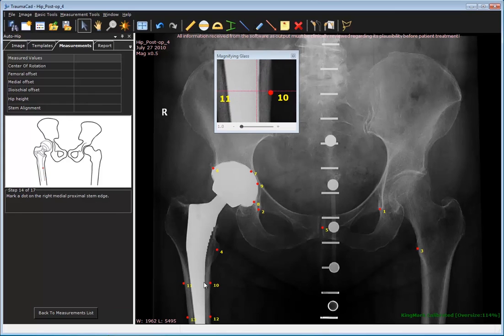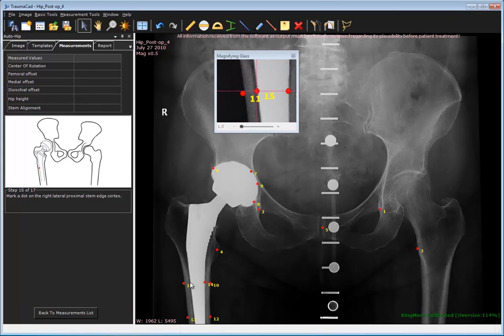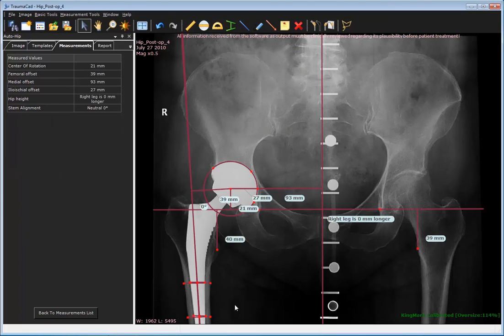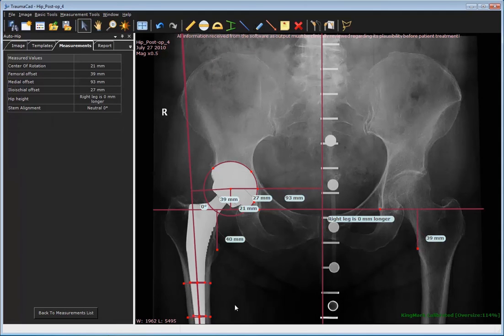In addition to the measurements shown before, stem alignment is now also added. In addition to the axis of the femur, it compares the actual axis of the stem to the axis of the femur.